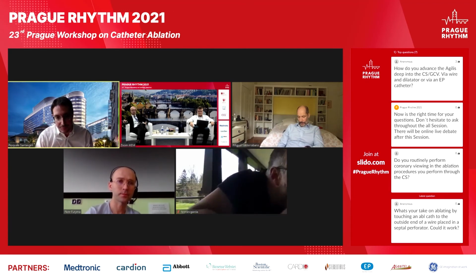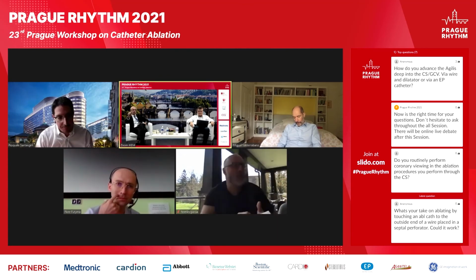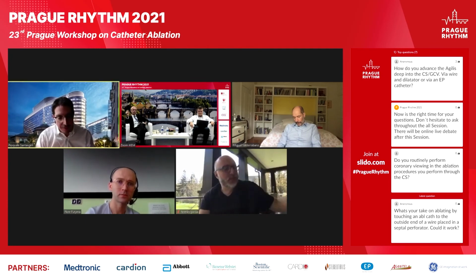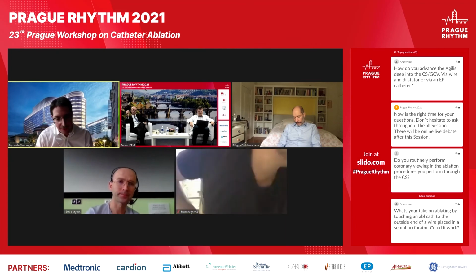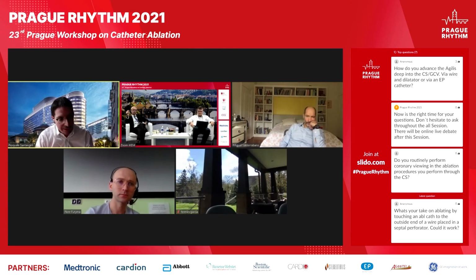But okay, if you have a patient with non-ischemic cardiomyopathy, do you always start with simultaneous endo and epi mapping, or do you start only with endo and epi in the next procedure? So we try to characterize the patient either pre-procedure when possible or during the procedure. At our institution, about 60% of non-ischemics have an anteroseptal substrate, which is mostly intramural and localized in the anterior wall close to the aortic annulus.